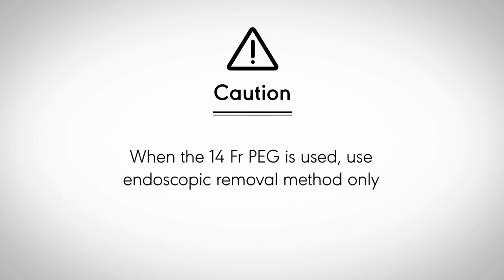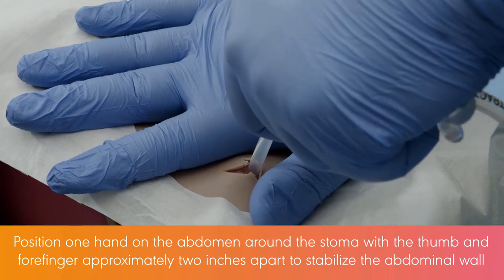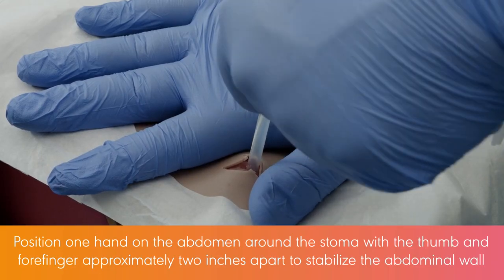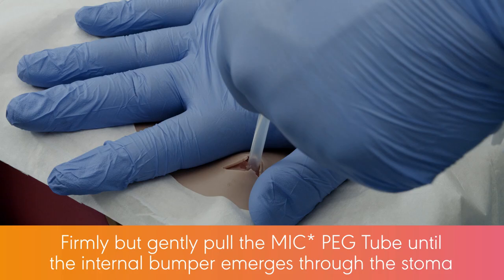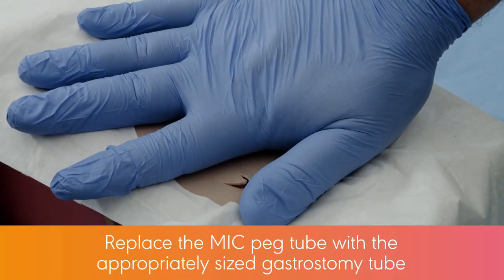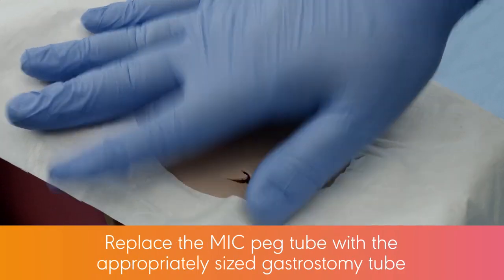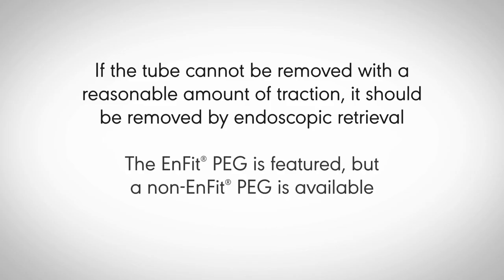Caution: when the 14 French PEG is used, use the endoscopic removal method only. Position one hand on the abdomen around the stoma with the thumb and forefinger approximately 2 inches apart to stabilize the abdominal wall. Grasp the tube with the opposite hand next to the stoma site. Firmly but gently pull the MIC-PEG tube until the internal bumper emerges through the stoma. Replace the MIC-PEG tube with the appropriately sized gastrostomy tube. If the tube cannot be removed with a reasonable amount of traction, it should be removed by endoscopic retrieval. The ENFit PEG is featured, but a non-ENFit PEG is available.